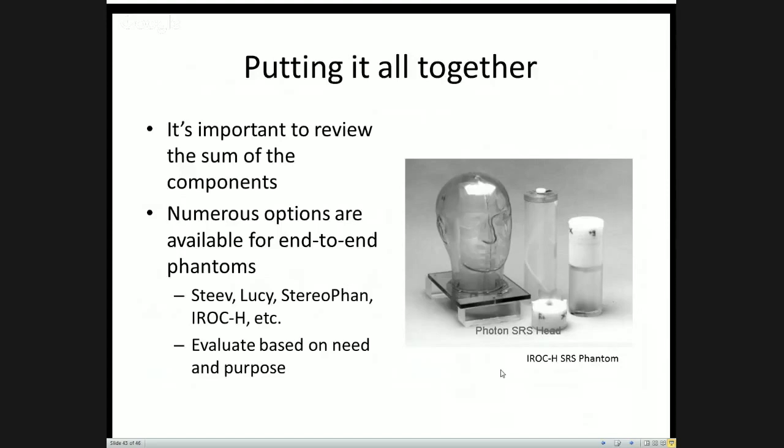You can evaluate the different options based on the need and the purpose and the things that you want to use them for. But I think it's a good idea to be able to check, putting some sort of anthropomorphic phantom into a immobilization, simming it, contouring it, planning it, delivering that plan, and making sure that it's all matching up with what you hope to get at the end of treatment.